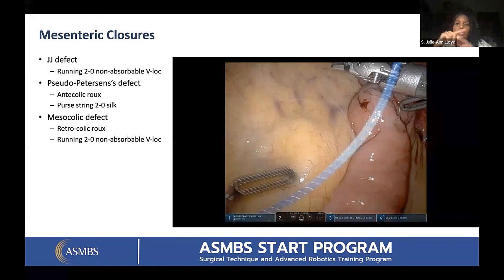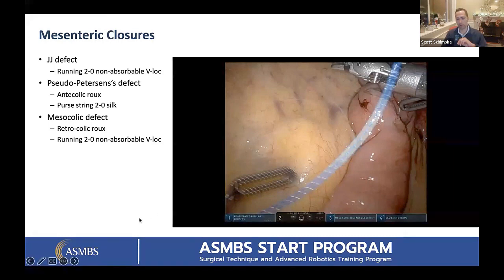And you guys mentioned there's a certain direction to rotate the bowel. Can you go over that when you're doing a GJ versus a JJ? Because I think you only mentioned one of them before. Oh, I didn't have the video on here, but yeah, once you have the GJ done, you run the bowel and essentially you're going in a counterclockwise fashion to set up the JJ.